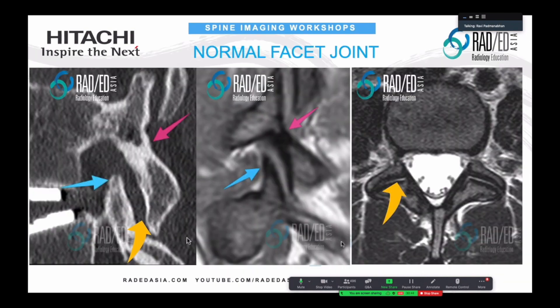If we look at the facet joint, it is basically composed of the joint between the inferior articular facet and the superior articular facet, with the joint space in between. On MRI, this is a PD sequence so we're seeing intermediate signal. On T1 you would see low signal, and on T2 you may see a thin amount of fluid in the facet joint or no fluid at all — that's the normal appearance.